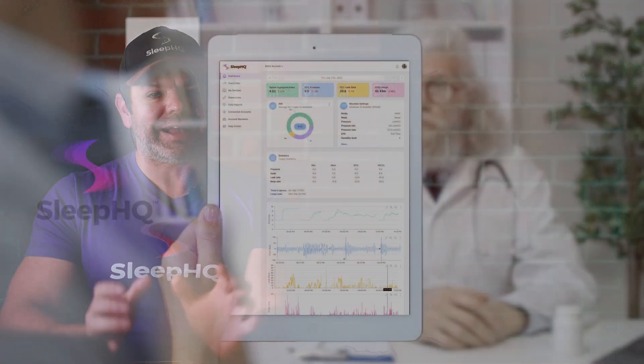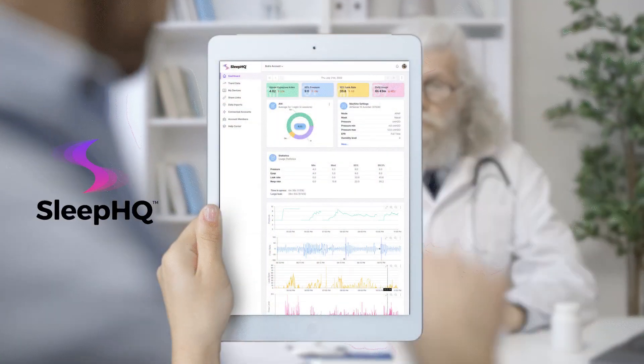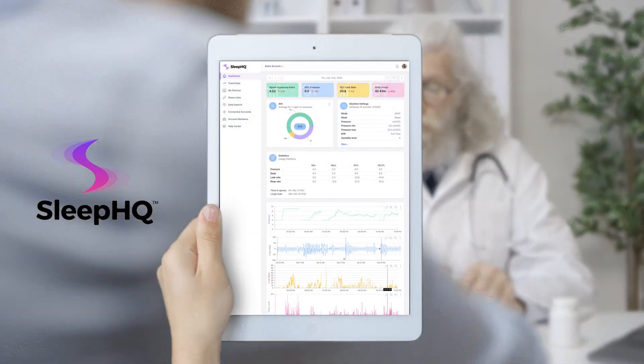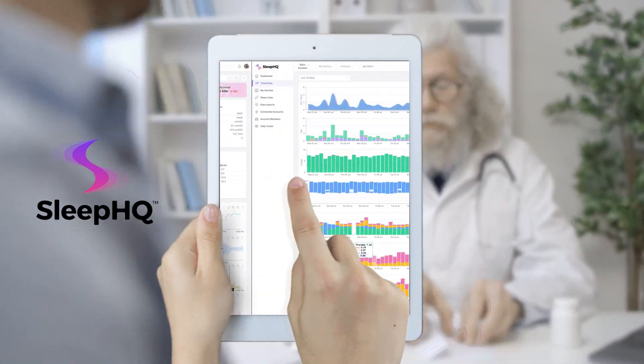G'day mates, this video is for clinicians, doctors, and industry professionals. However, if you're a patient, feel free to tag along. It's a quick tutorial on Sleep HQ Consult, which is our clinician platform. It's very similar to Sleep HQ but has a few extra tools to help manage larger patient numbers.